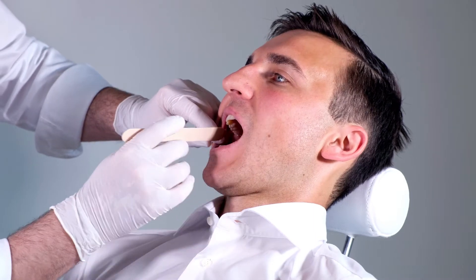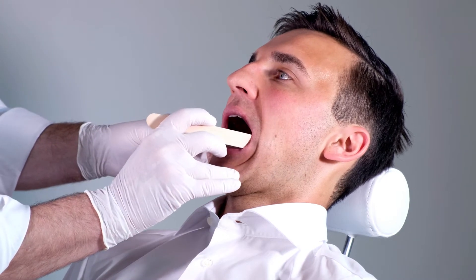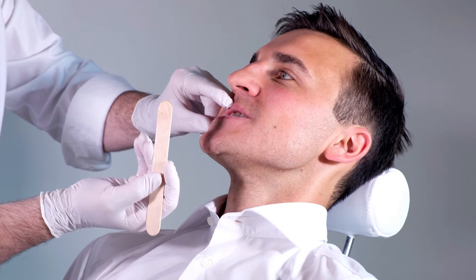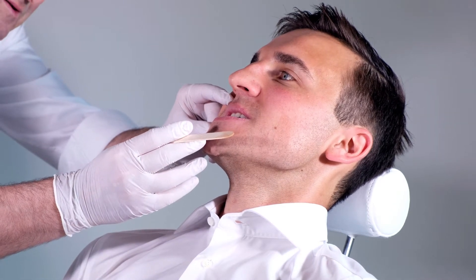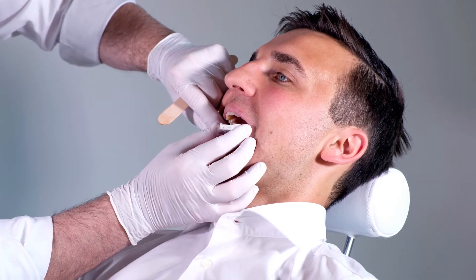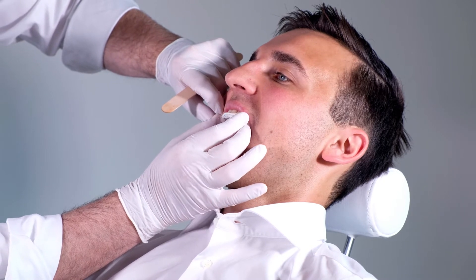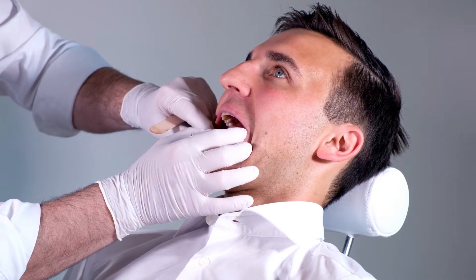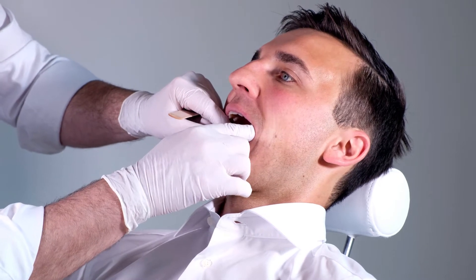Before fitting the appliance, check the patient's dental status and condition. You must also determine the mandibular advancement by letting the patient repeatedly move his or her lower jaw forward as far as possible. Also check whether the oral trays in their original form match the patient's dental arches. If not, the width of the trays can be altered after heating them in hot water.